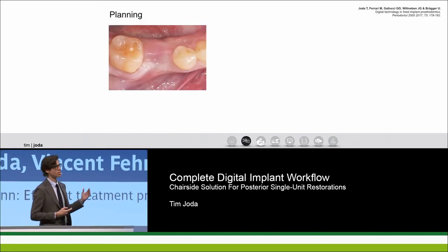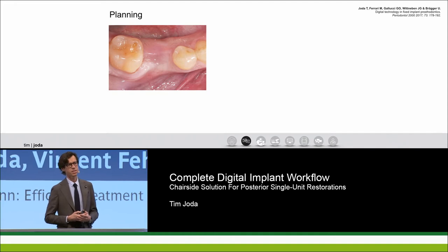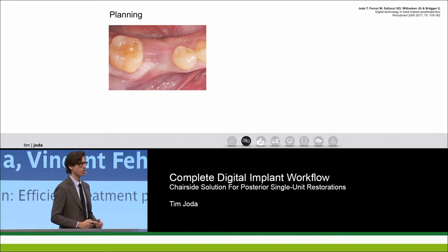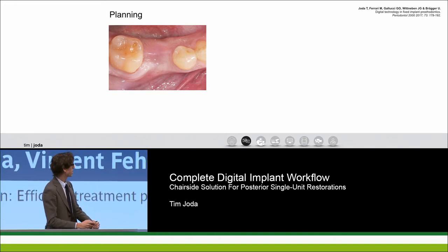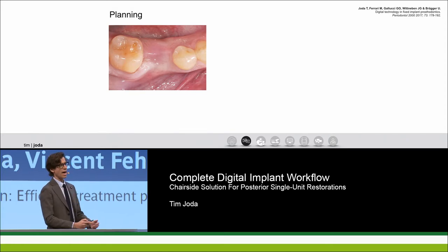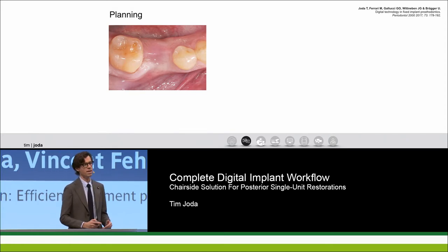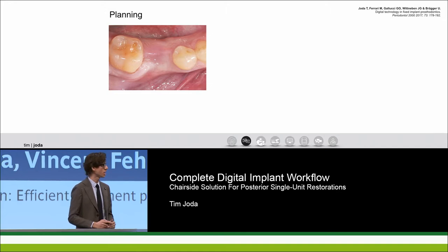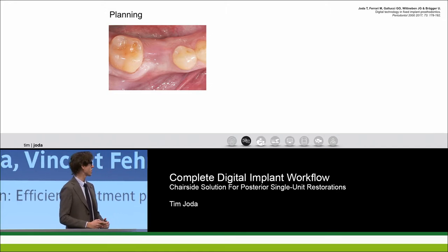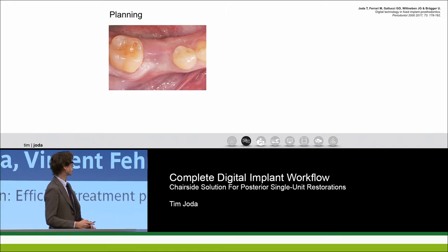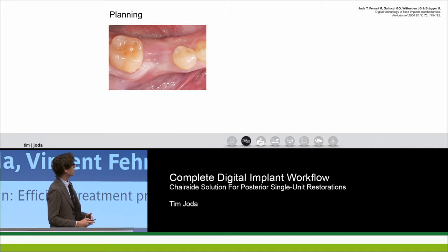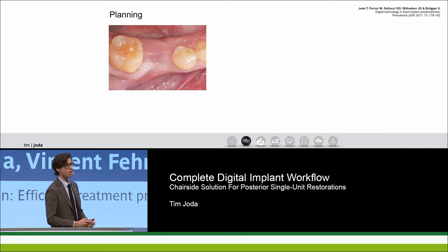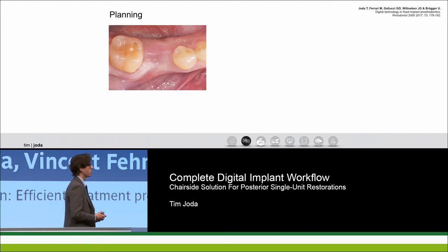Let's start with the clinical case. This is the initial situation — it was a milk tooth, the second milk molar, which had to be extracted. There is a congenital absence of the permanent tooth, so it's an ideal situation for placing an implant in this 33-year-old male patient.